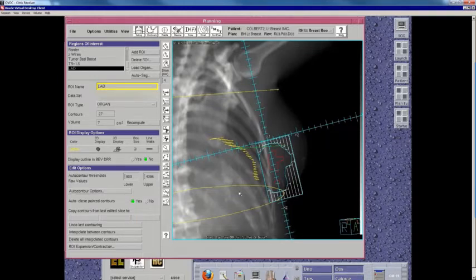So we are very confident nowadays that when we simulate a patient who had an oncoplastic surgery at MD Anderson, whatever radio-opaque clips we see in the breast are indeed defining the tumor bed and are not from the plastic surgeon. One little parenthetical comment is that every now and then calcifications can look like tumor bed clips, and that can make life complicated. That was a mistake I made in like 2011, when I was a junior attending. I contoured one calcification that I thought was a clip, and the boost was big. And actually, the patient pointed it out to me, and she was a physician, and I felt really sheepish about that.